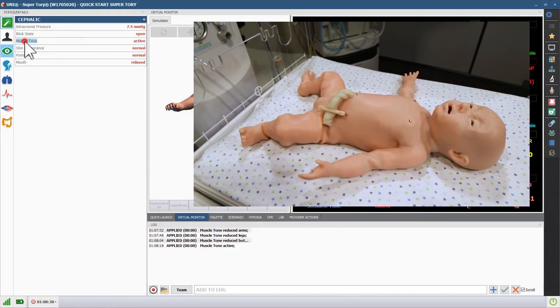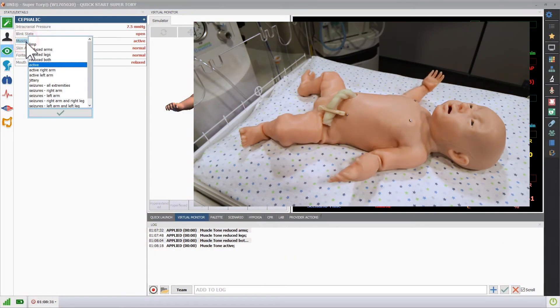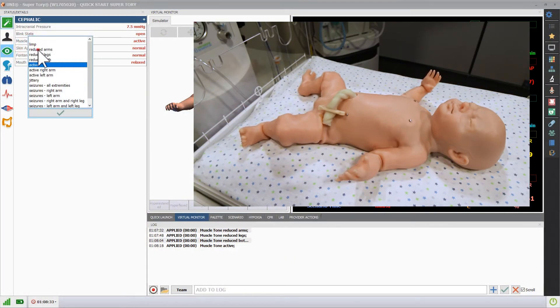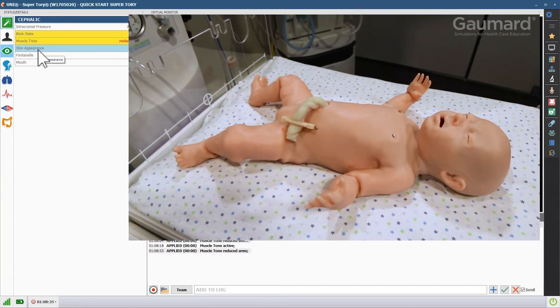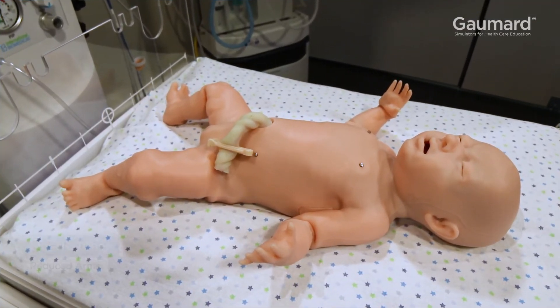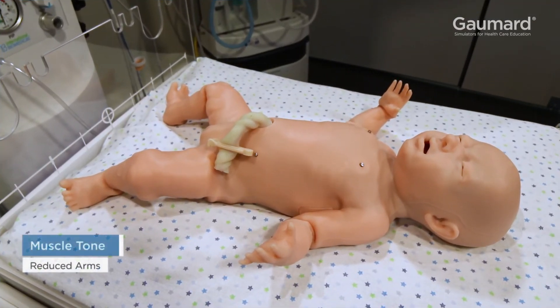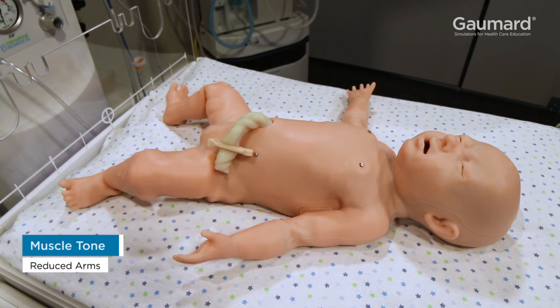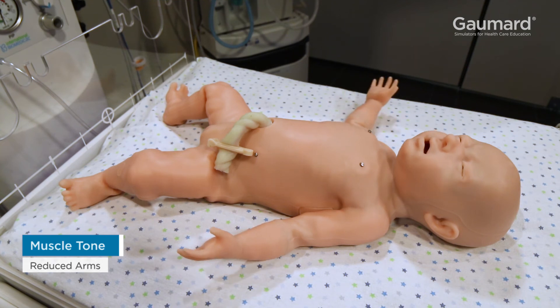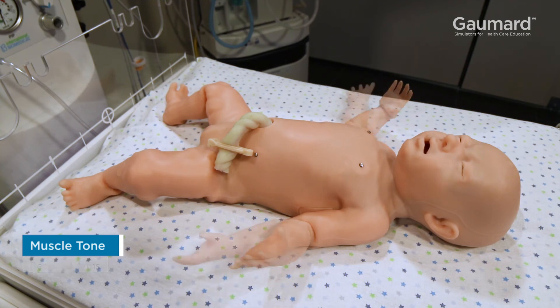Click the muscle tone vital and choose the appropriate limb or limb group and level to generate different muscular activity. Supertory features active robotics in the arms and legs that generate realistic and life-like movements.